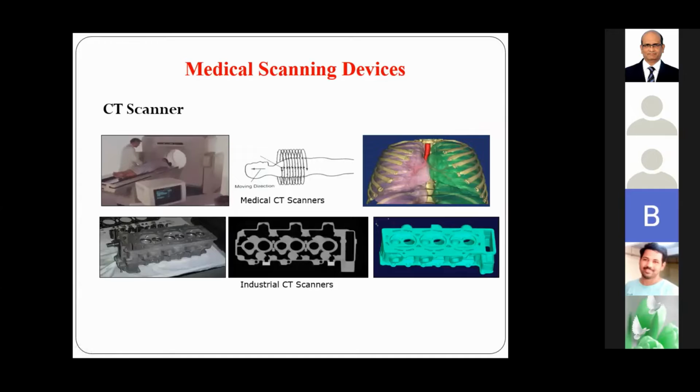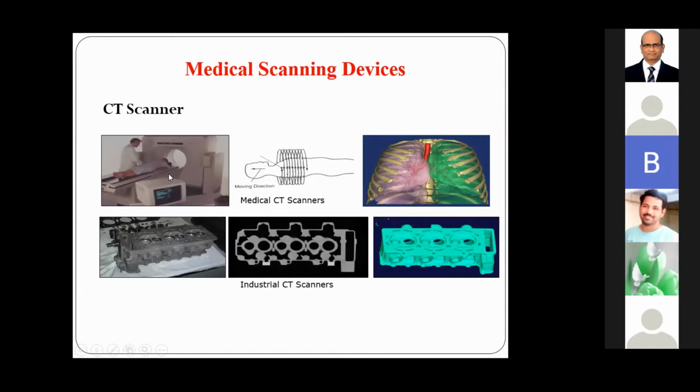In this, the first requirement is the medical scanning device. First we have to capture the data of the patient. Nowadays CT is used in the medical field as well as in industry, where we require NDT, non-destructive testing. Suppose this is a casting object and I want to check for blowholes. With micro CT, they take the micro CT scan of this object and then check each and every layer.